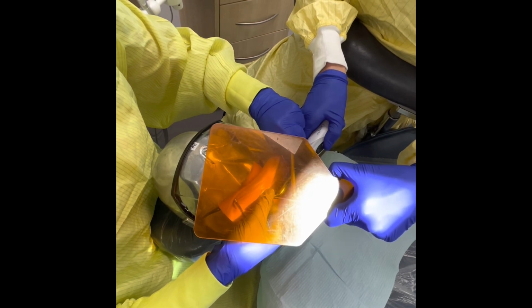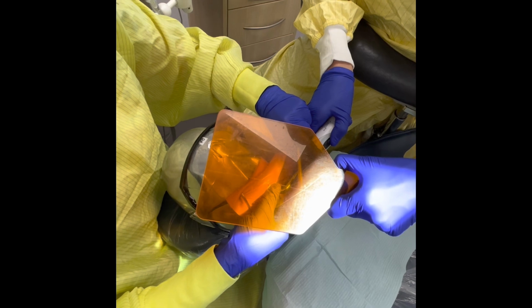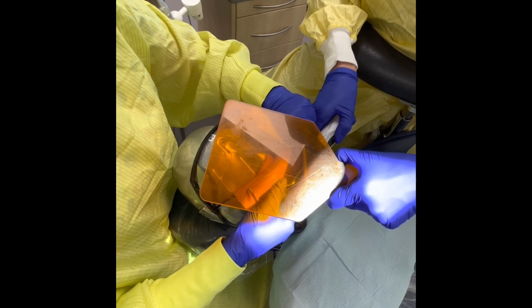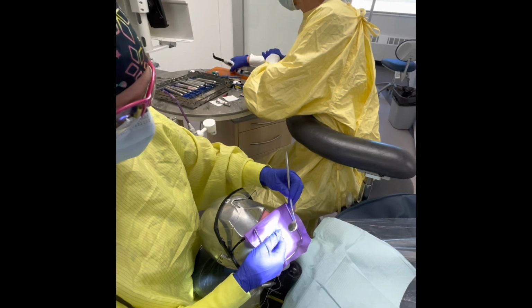This is what I call my time to rest during the procedure. Rest and regroup. Yes. Thinking what comes next. And what's going to come next is Amanda is going to remove her plastic matrix. So I already know in my mind what I want to pass her.